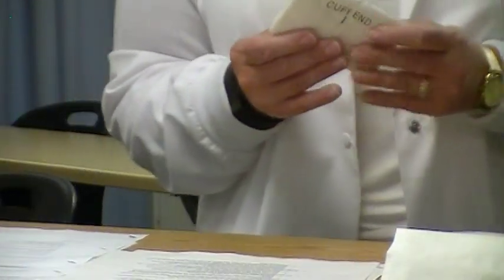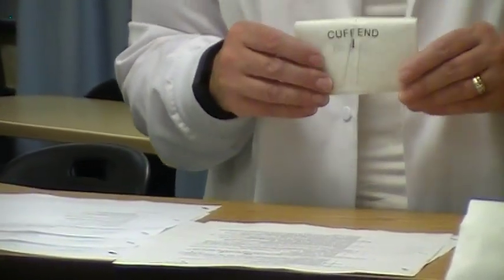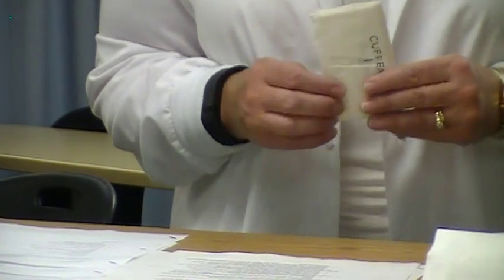When you're opening your package of gloves, be careful not to let it fall on anything that is sterile. Remember that in order to maintain its sterileness, it can only touch other things that are sterile. If it touches anything that we are not sure of or that we know is contaminated, then we have to consider that item contaminated as well.